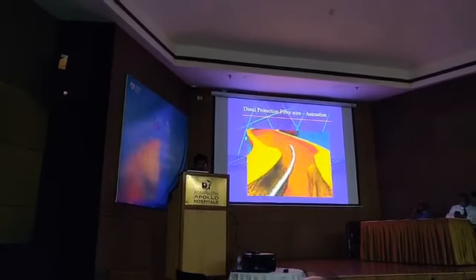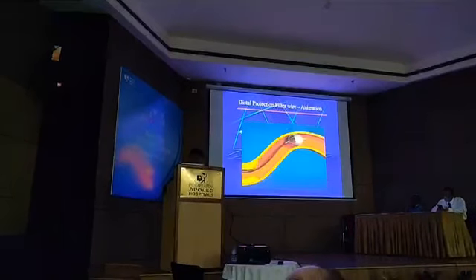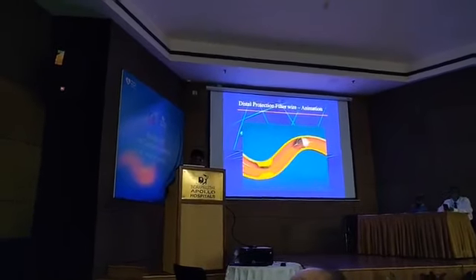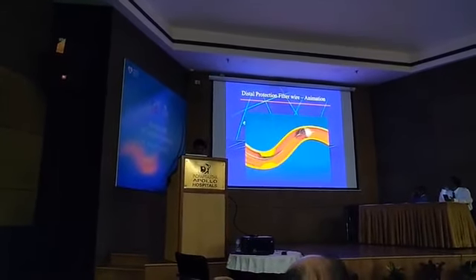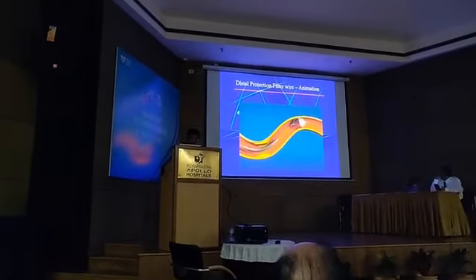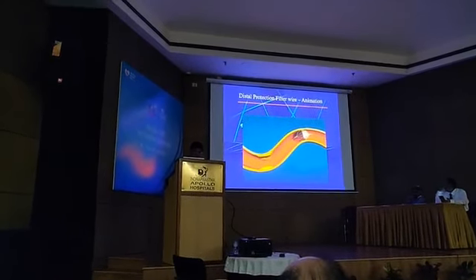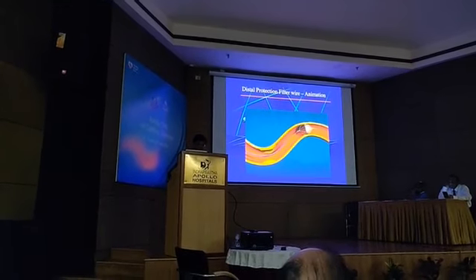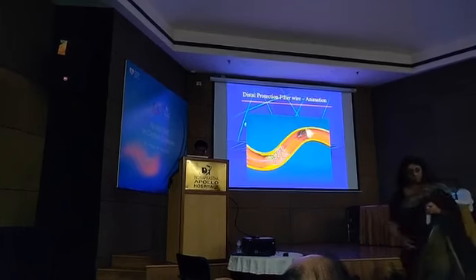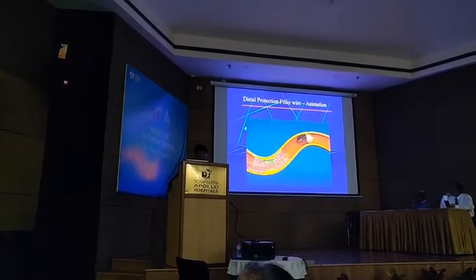This is how the filter wire works. This is the protection device which is placed distally. This is the filter. You remove over the wire, on the wire. Then you perform the balloon inflation. The emboli go and get stuck in the filter. Put the stent, deploy the stent. Again, there are a few emboli which are captured by the filter.